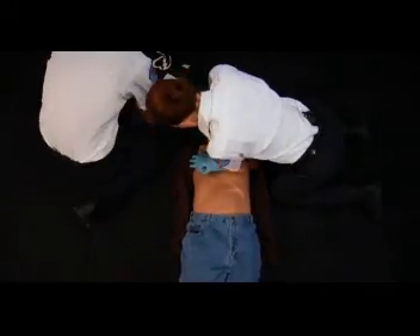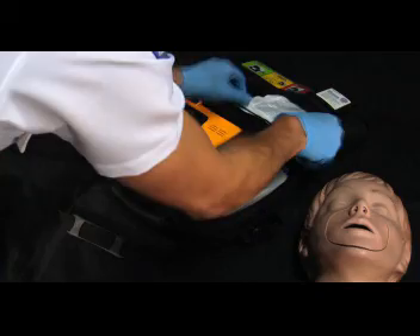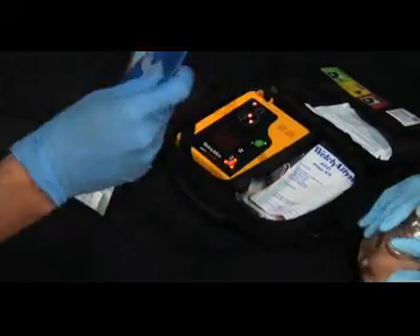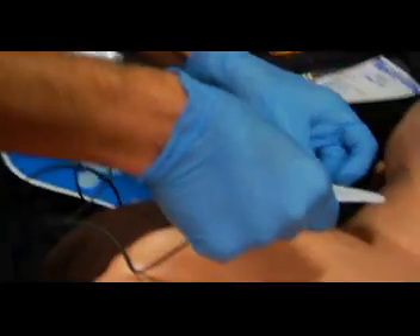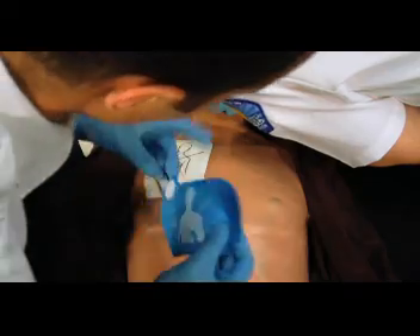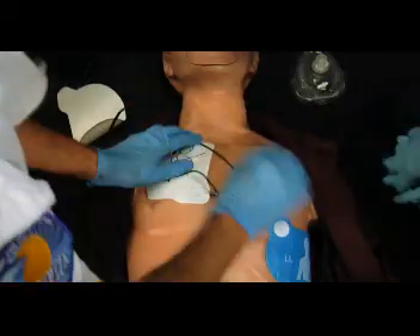Now we'll focus on pad placement and how to properly clear the patient for defibrillation. When there are two rescuers, the first rescuer continues CPR while the second rescuer prepares the AED. Open the case and turn on the AED. Follow the AED prompts and apply pads to the patient's bare chest. Peel off the backing and apply the sticky side according to the picture. Apply one pad to the right upper chest and the other to the left side, just below the armpit. Press the pads down firmly on the patient's skin.